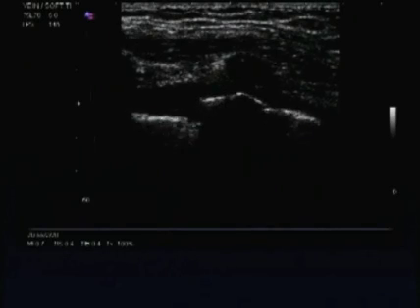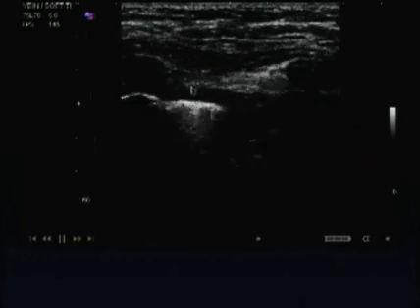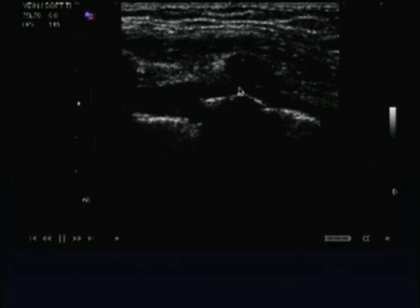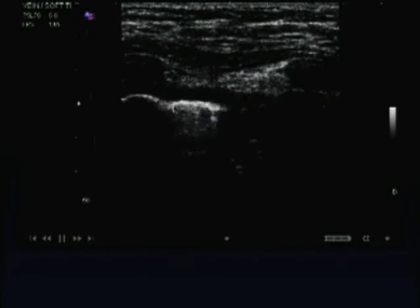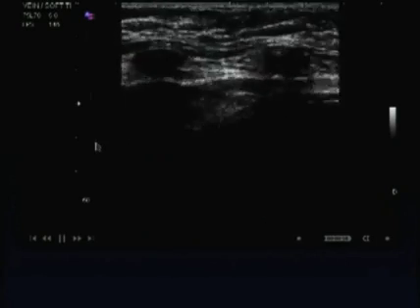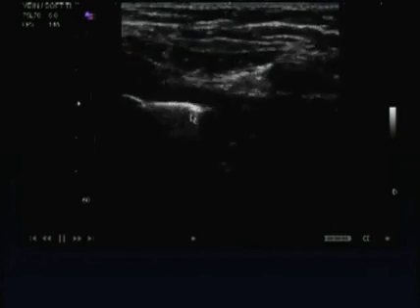Here's a much smaller effusion. Here we see the rib and the rib shadow. The pleural line's right here, and right in here there can be seen just a very thin layer of effusion. This is presumably a fissure of the lung, causing that apparent step off. And here, right here is the fissure, as I mentioned, with some step off.